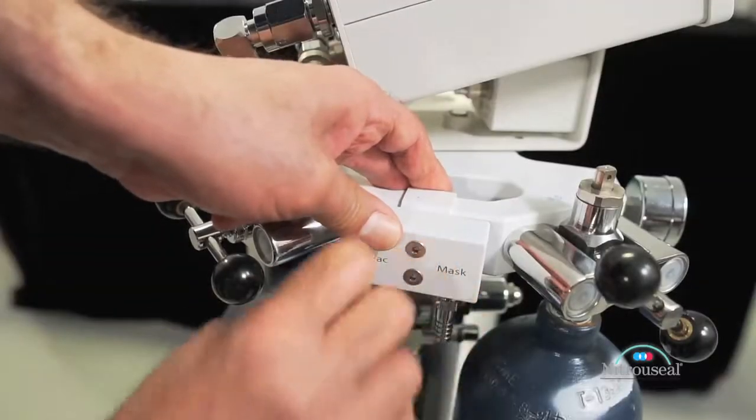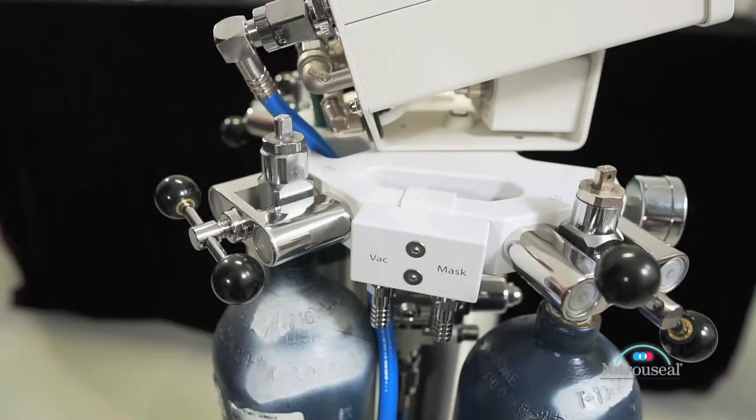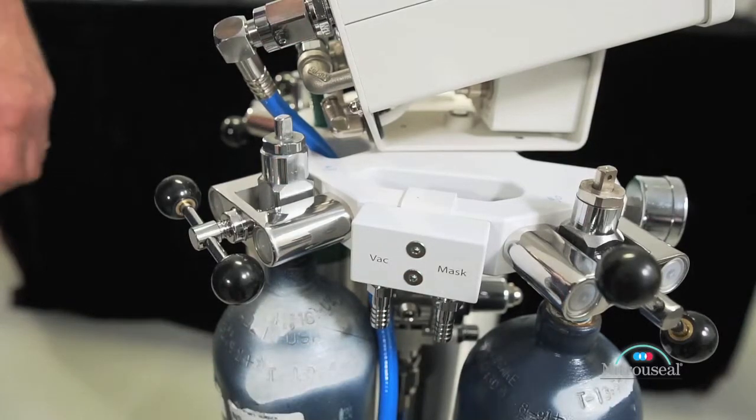When correctly installed, the vacuum block will provide a pair of spaced nipples pointing in a downward direction, one marked VAC and the other marked MASK.